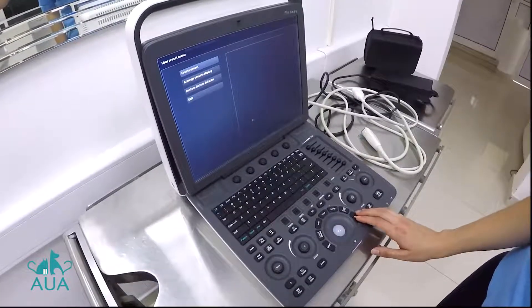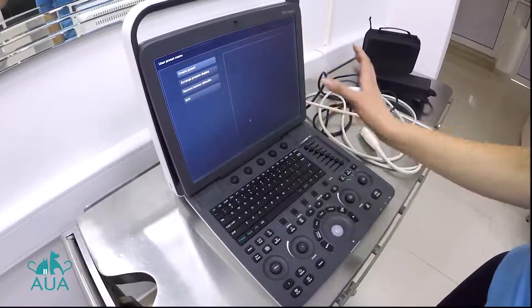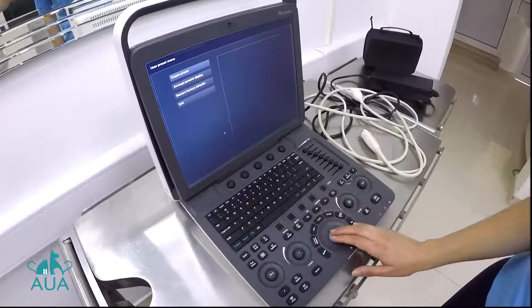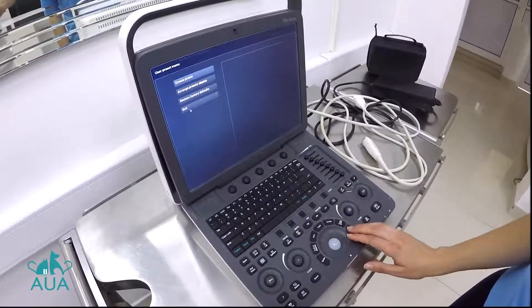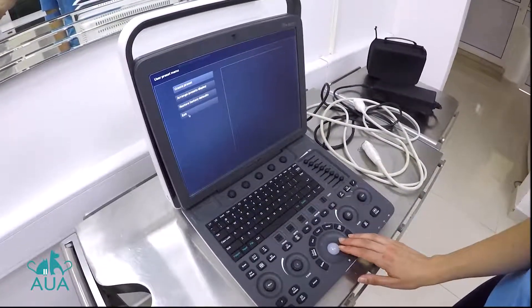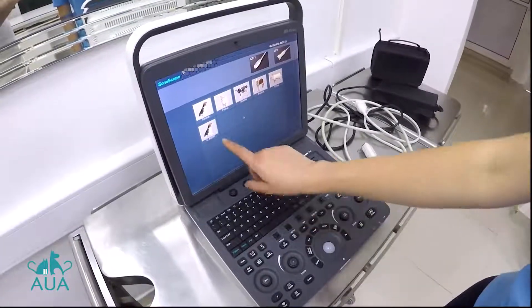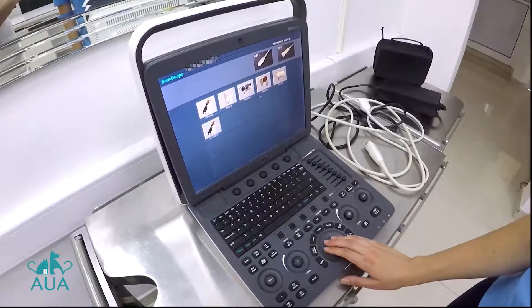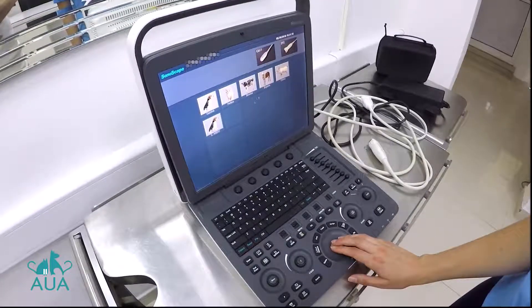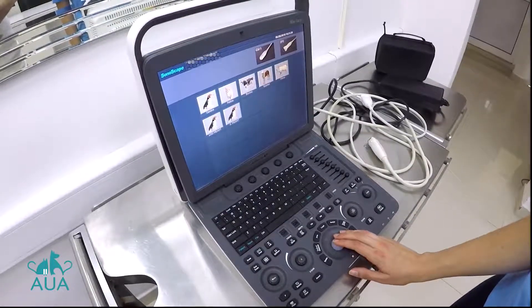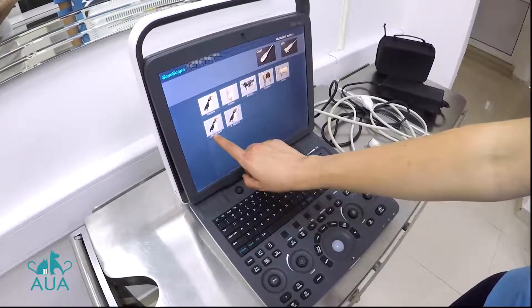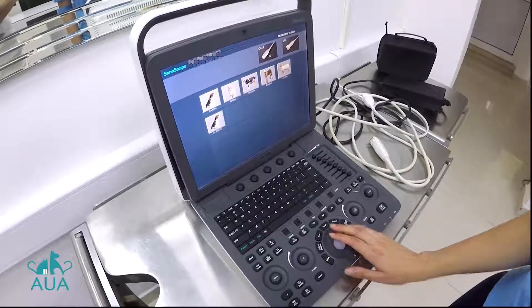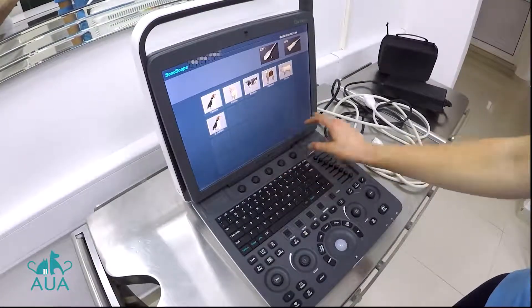It won't give you any confirmation that it's worked, but everything's saved. If you then go into exit, it's there as a new exam on that probe. It'll only be available for the probe you've set it on. If you go over to the phased array, you can see I've added cardiac ones there — you can add as many as you have spare boxes.